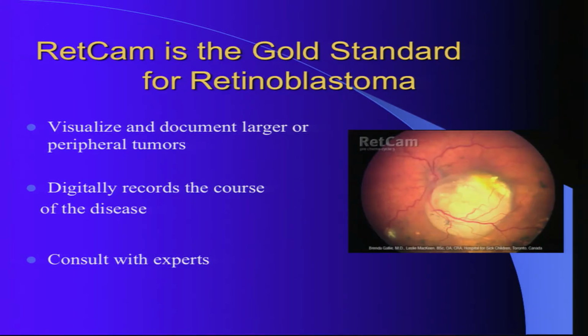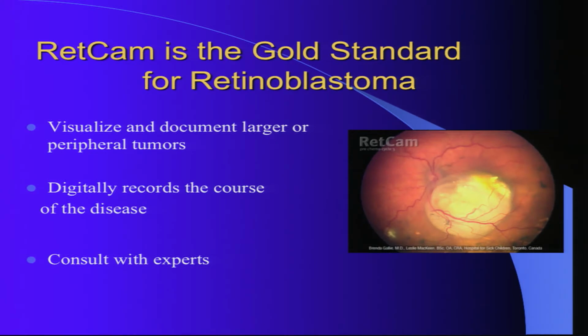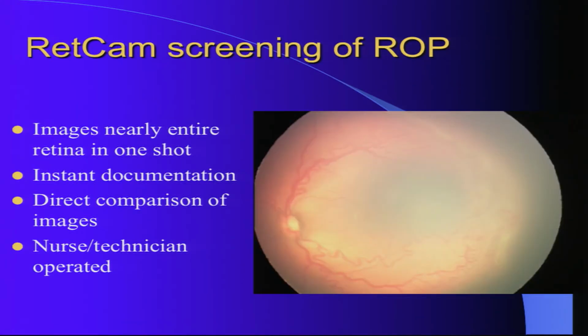I think more and more in our country, we are also realizing that we need this particular modality or maybe other alternatives which are there. I think this moves of its own. And of course, you can document retinoblastoma very well. You can look at the course of the disease when you treat them, and also for a recurrence. And you can even consult an expert very easily. That's what is very important with this imaging.